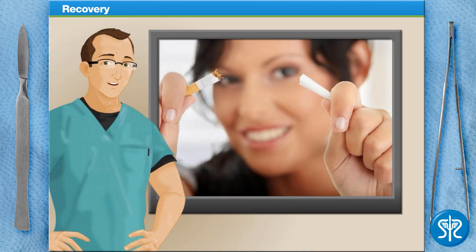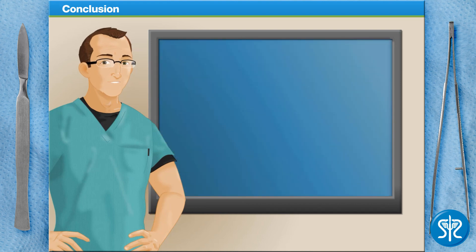It's also suggested that patients do not smoke for at least 24 hours after their surgery. Smoking may not only delay healing, but it will also reduce the blood supply and could introduce germs and contaminants to the surgery area. And that's a wisdom tooth extraction.